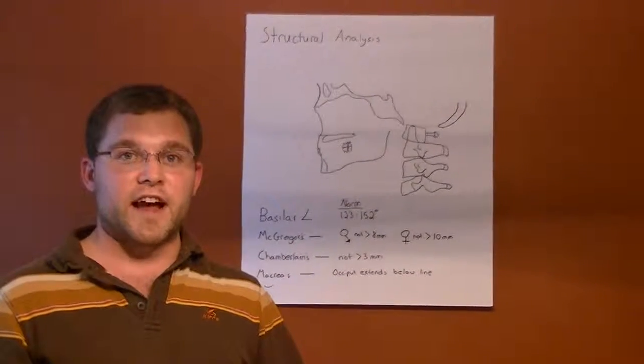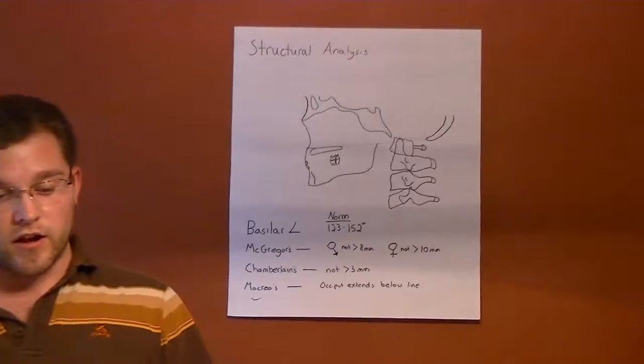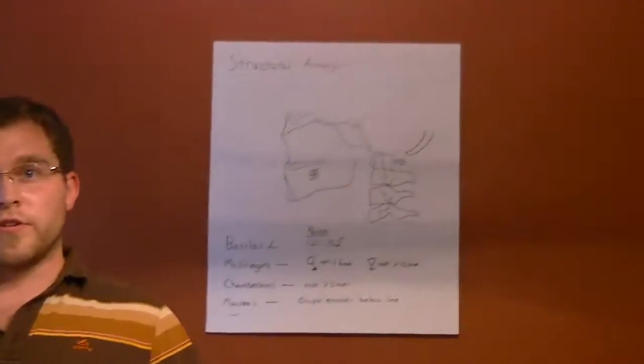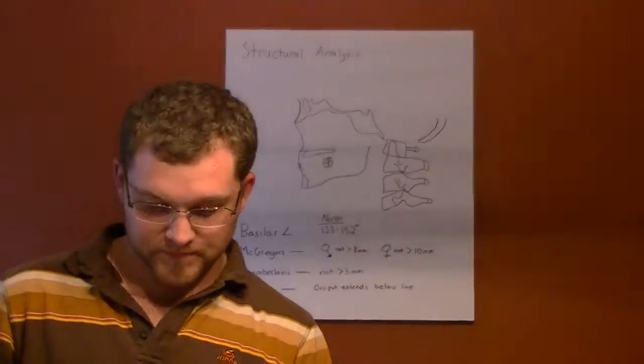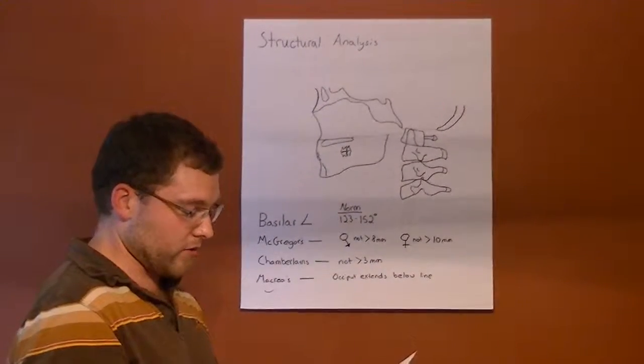Another thing that appears exactly like it is basilar impression. This is caused by a disorder. Typically, it's going to be caused by either rickets or osteomalacia. A couple other anomalies we went over.